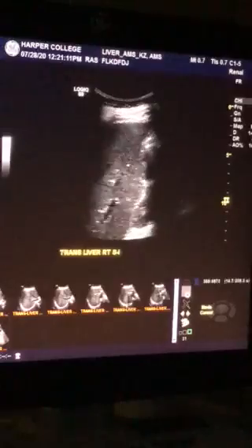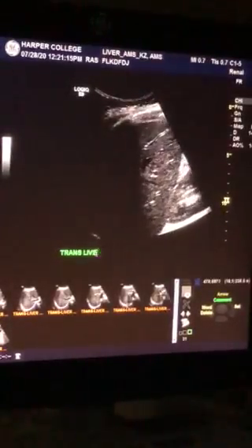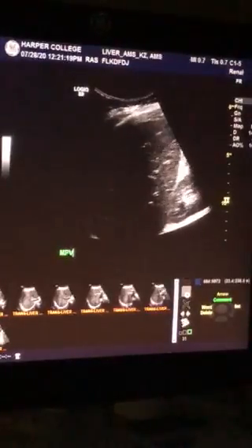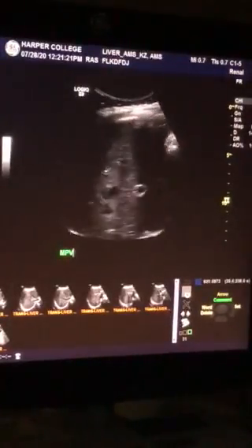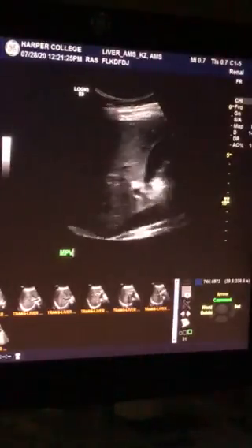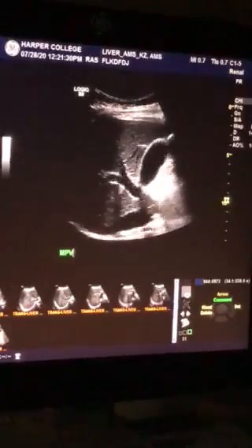All right. So next I'm going to assess the vascularity of the liver by looking at the main portal vein. We want to make sure that flow is heading towards the liver in a hepatopedal fashion and that the flow is continuous. So I'm going to use an intercostal window to elongate her main portal vein.